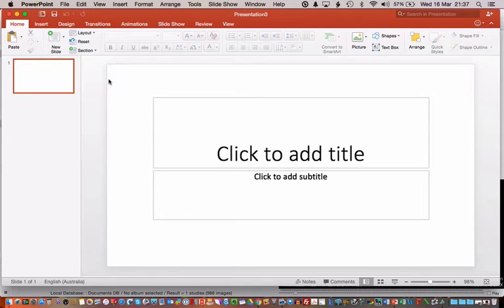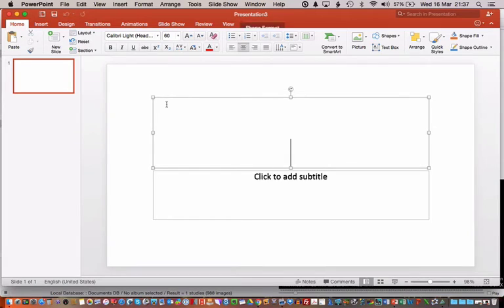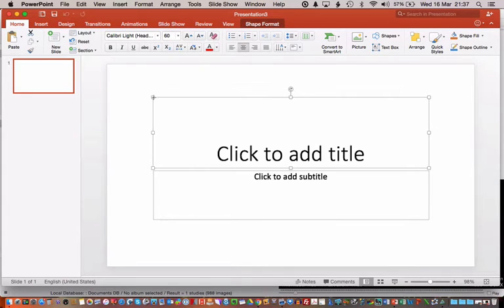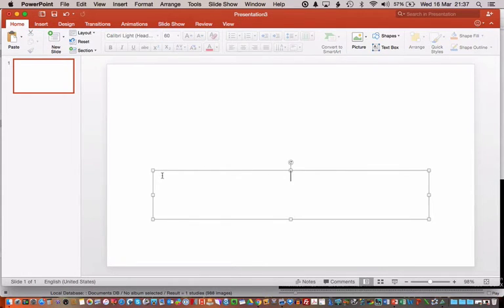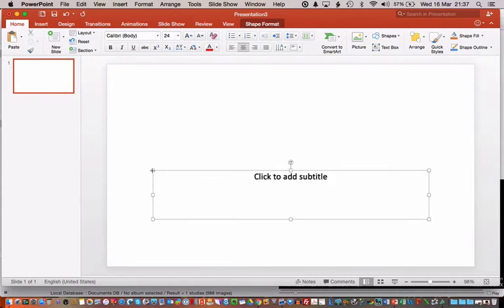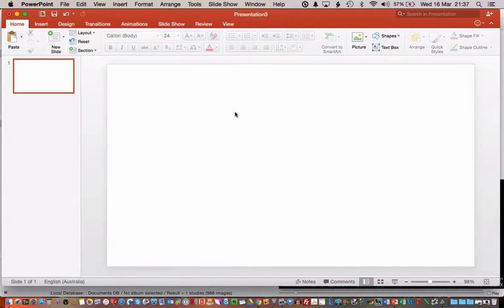Just open a new presentation. You need a blank slide and there's a little trick to this. You need to get rid of everything on the slide. Get rid of the text boxes because you need a completely blank slide.